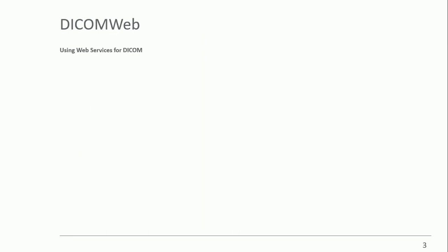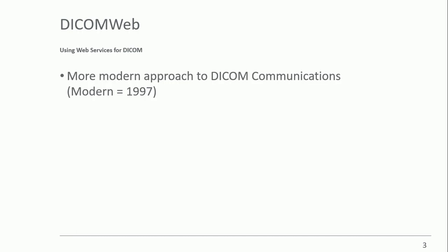Again, you can learn a lot more about those in the DICOM standard, or I can do another video that discusses those. But that said, since we're talking about DICOM communications, what we're talking about here is DICOM communications using TCP at a very low level. But DICOM also supports, also in part 18, it talks about DICOMweb, right? Which is WADO, QIDO, STOW. This allows us to leverage web services. So it's a much more modern approach to DICOM communications.